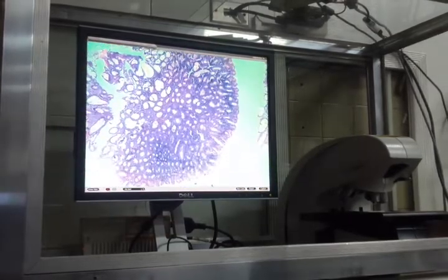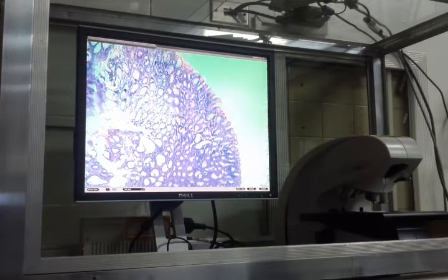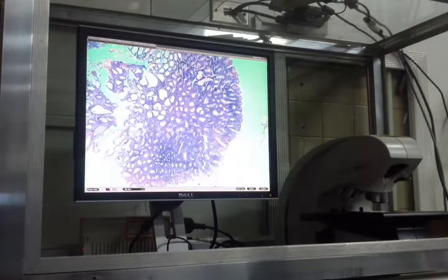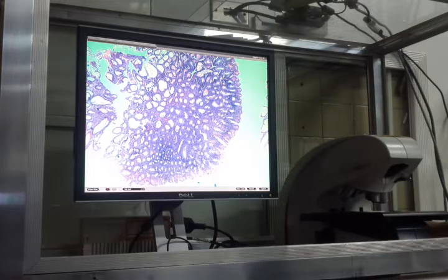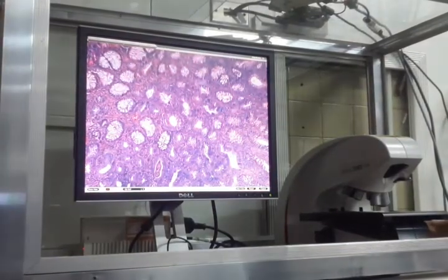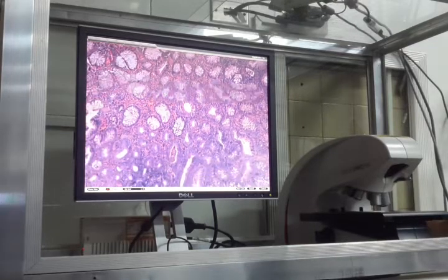Okay, here you have a tissue coming from the colon. Apparently, it's a polypoid tissue. What is seen here is what part or what layers are seen. That's just the mucosa layer. You don't see the muscularis mucosa. You don't see the muscular layer. You don't see the submucosa, and you don't see the adventitial layer.